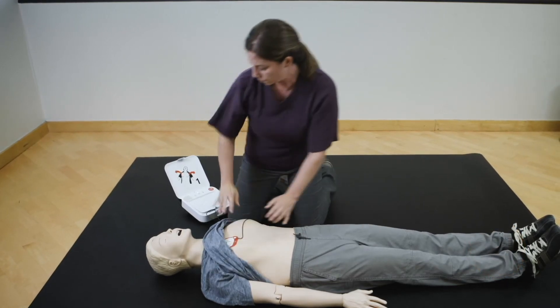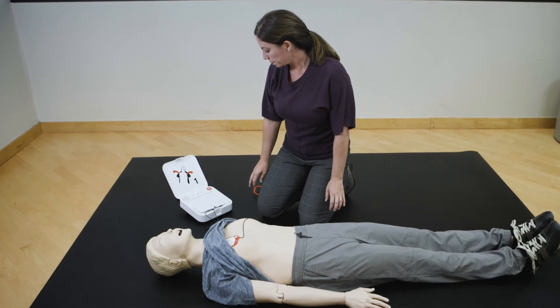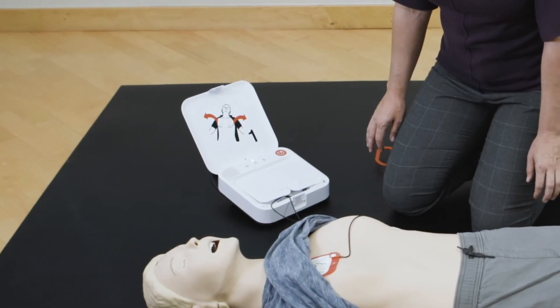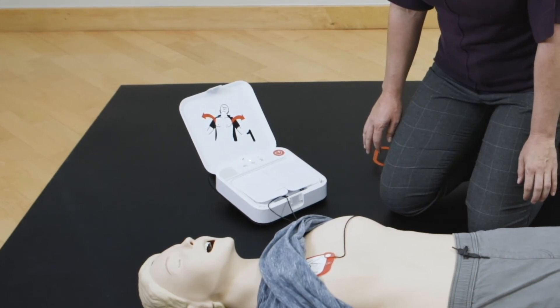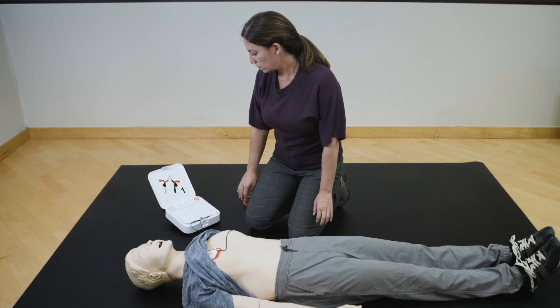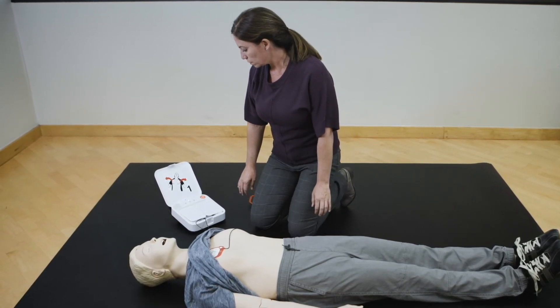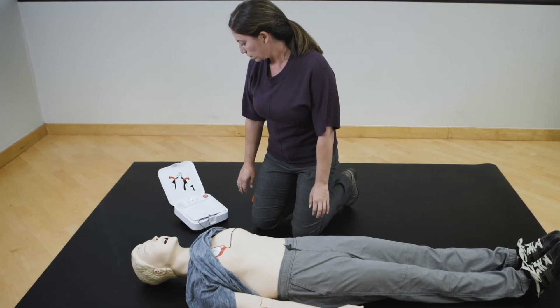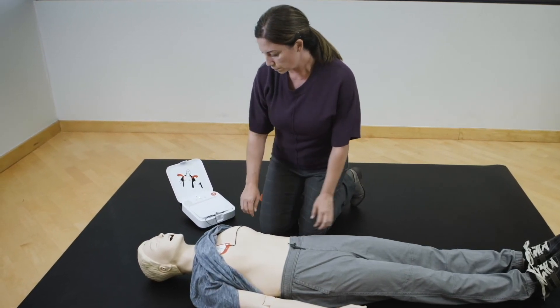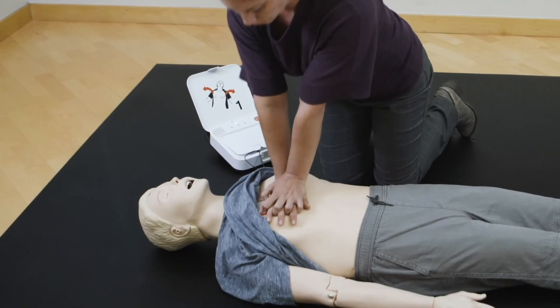Stop chest compressions. Do not touch patient. Analyzing heart rhythm. Everyone clear. Do not touch patient. Delivering shock. Shock delivered. Resume chest compressions. Push down hard at least two inches.